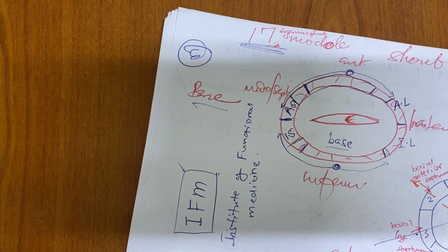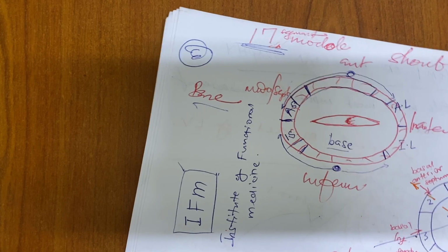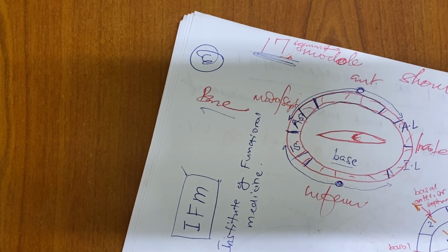That is apical four chamber. Now we're talking of apical two chamber. Which are the chambers? We have said left atrium and left ventricle. We are focusing on the left side. How would they look like? Orientation.